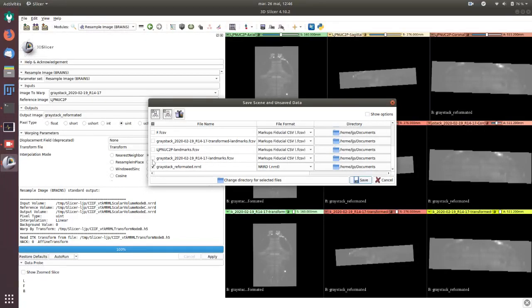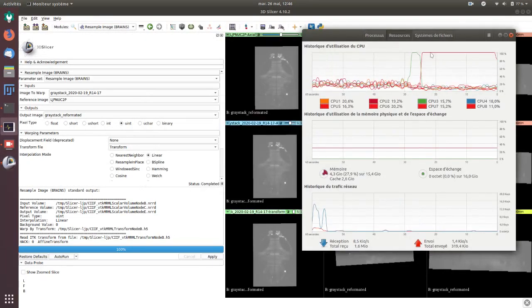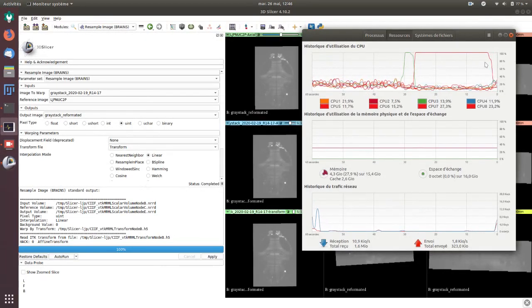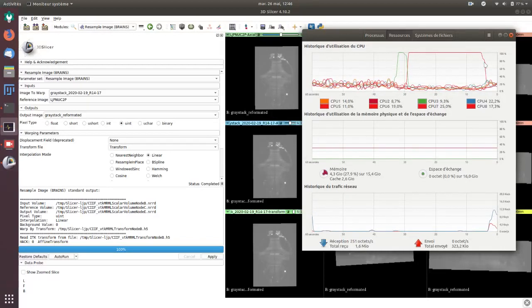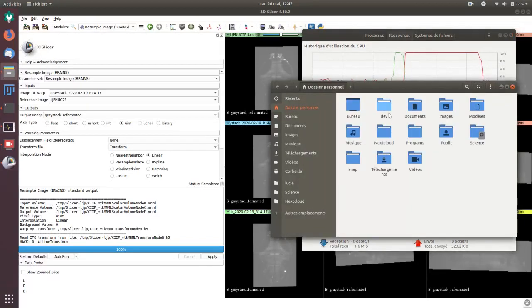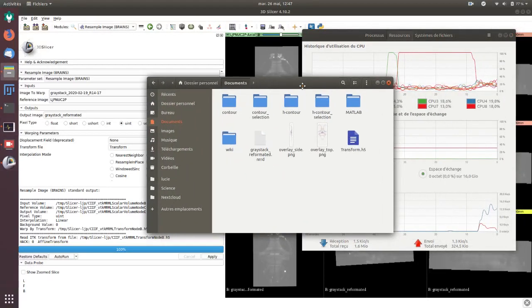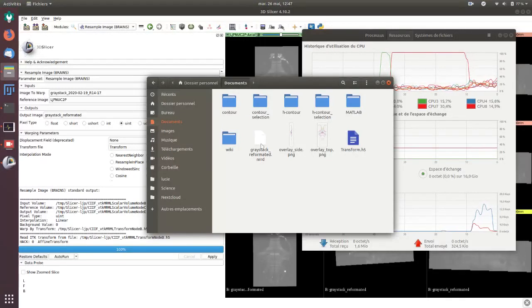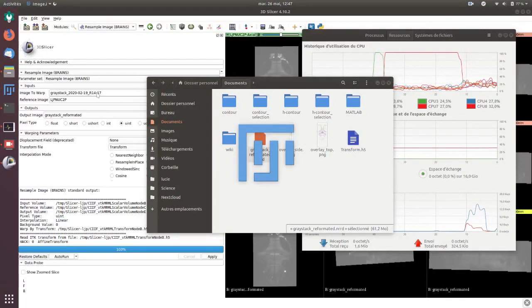I export the reformatted. I output this in, for example, documents save. This will take 20 seconds to export the files. Now I can open it, for example the gray stack reformatted. I can open it in ImageJ.